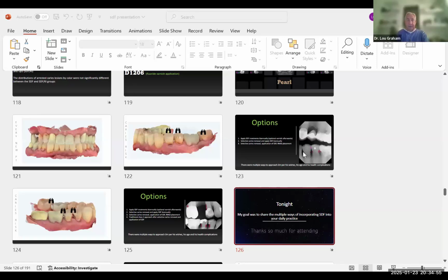So I don't want to confuse everybody. When you use a regular glass ionomer like the Riva self-cure, it is not light cured. So there is no light activating and pulling up, is my feeling. You also get a little bit more enhanced fluoride, but you get less compressive strength. I've been using self-cure glass ionomer for decades. There are speakers who say you shouldn't use it. I've been using it for decades, and I'm giving my age away. And I have seen great support when I've removed old composites or old crowns that I've rebuilt with glass ionomer. I don't see recurrent decay.